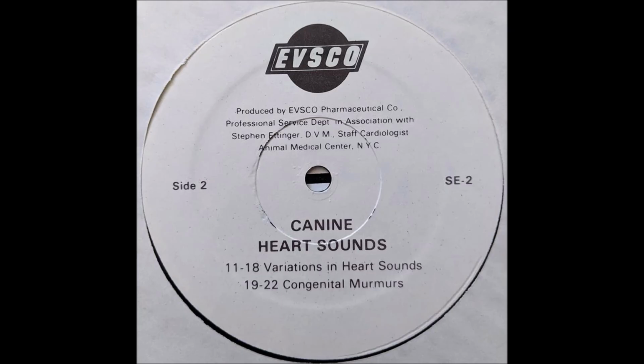This distinctive continuous murmur is best heard at the level of the aortic and pulmonic valves. Only a systolic murmur may be heard over the mitral and tricuspid valves. Listen to the continuous machinery murmur of a patent ductus recorded at the cranial thoracic wall of a dog.